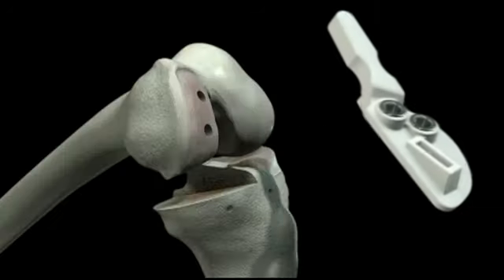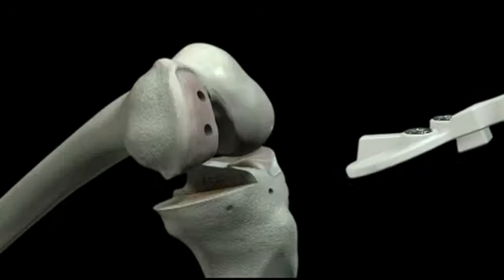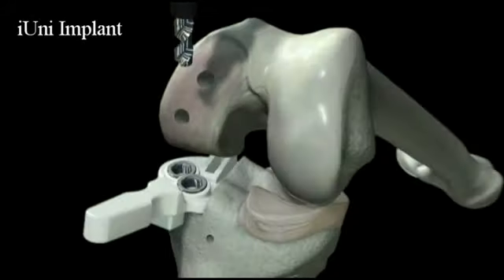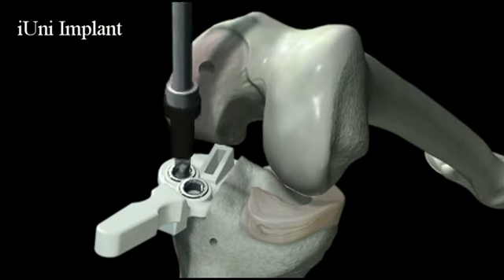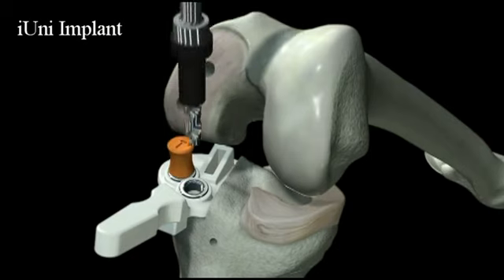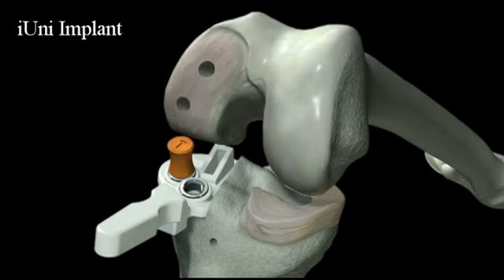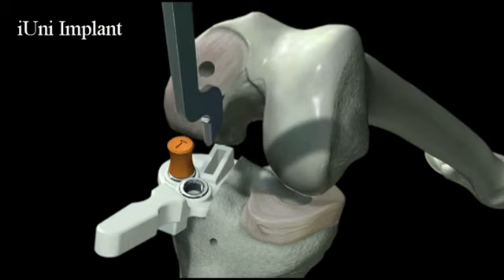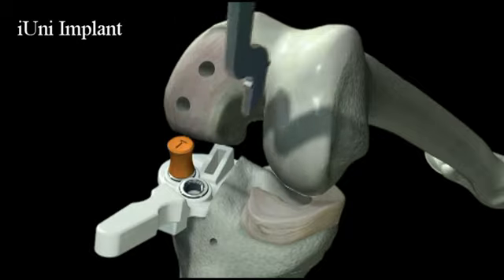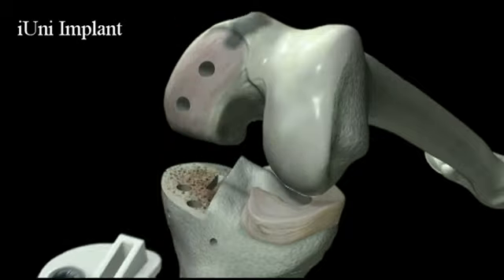Step 5. Tibial preparation. Place the tibial template and drill both holes to the stop sleeve. The tibial template should be flat against the vertical resection and follow the outline of the cortical rim. Next, using the orange disposable tibial peg marked T, pin the posterior hole only. Create a keel hole using the tibial keel punch preparation tool. Impact the keel punch by striking at the proximal end with a mallet.